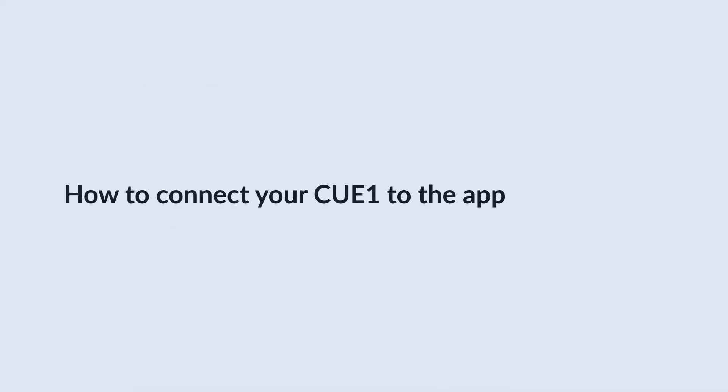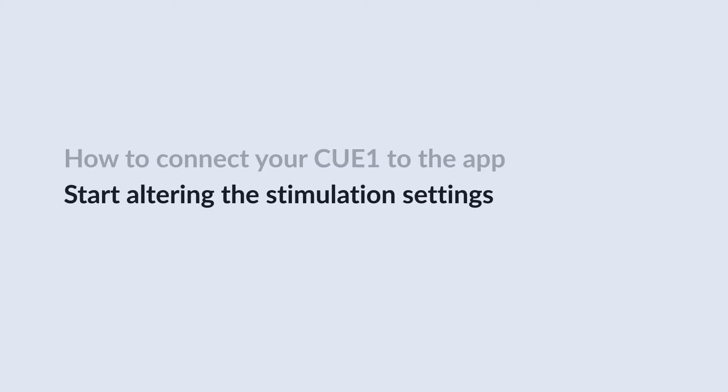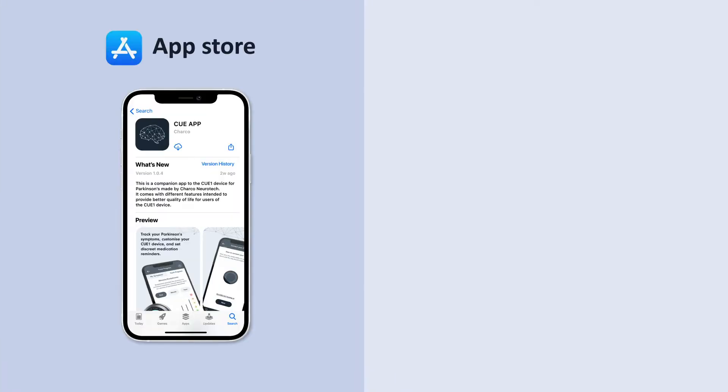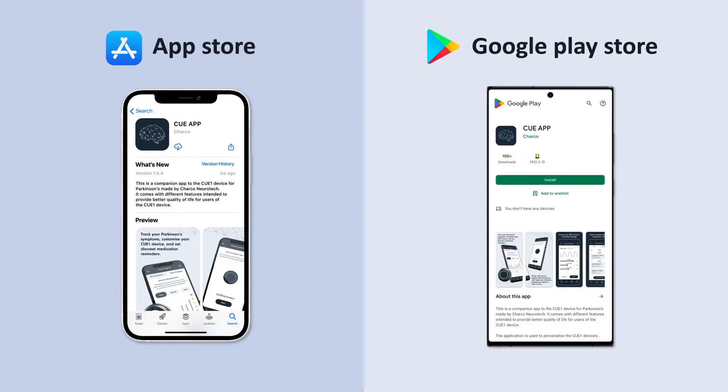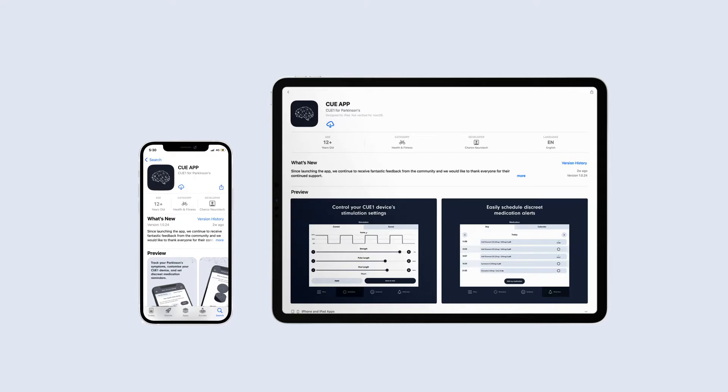In this video, we'll go through how to connect your Q1 to the app and start altering the stimulation settings. First of all, please download the QApp from the App Store on Apple devices and the Google Play Store on Android devices. You can use a phone or tablet, whichever is your preference.